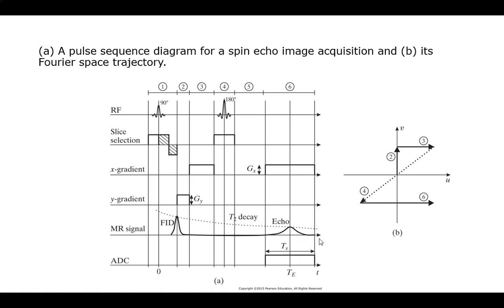And you will get no good measurements. So that's why whenever I'm doing that RF coil, I've got to sync it up with my Z. RF and Z must act in tandem. Otherwise, you excite lots of slices and you get a noisy signal.